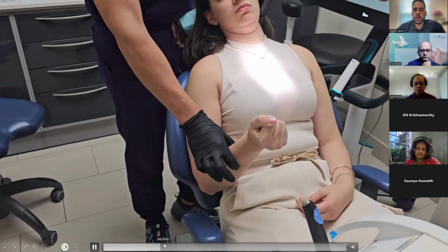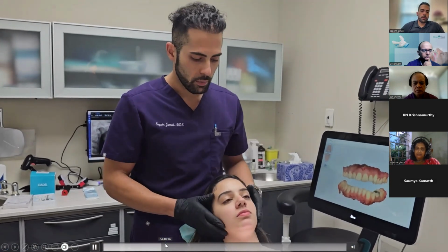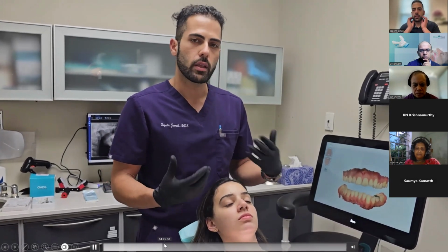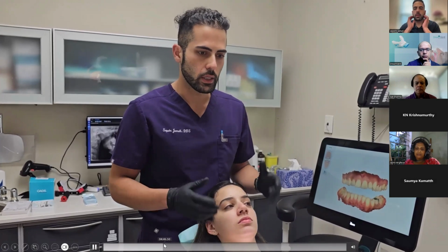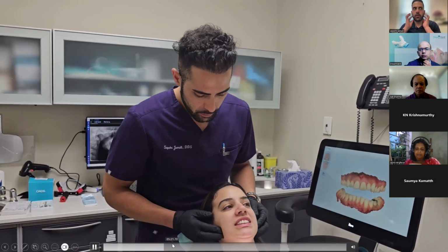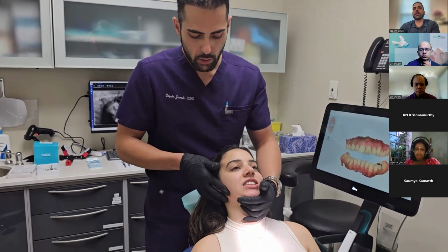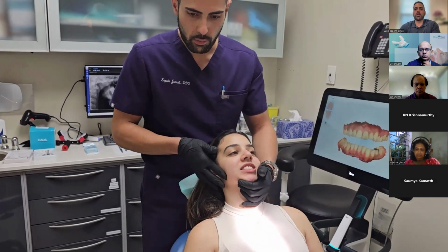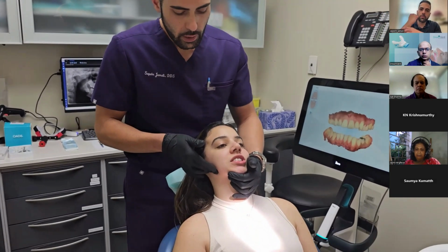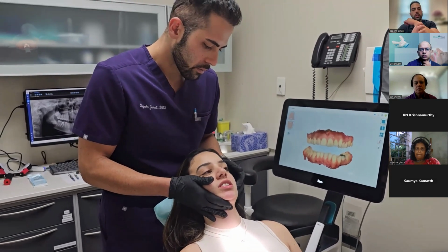This part is actually interesting. A lot of times patients don't know how to feel the tenderness because they never check the muscles of their face. So you start palpating their muscles and say, do you feel any tenderness? They say it feels a little bit tender because you're pressing on it. I say, okay, but does it feel tender like normal tender? And they don't know what tenderness in the muscle is. So I usually touch their hand and put the amount of pressure that I'm going to use for palpation of the muscles. And I ask them, is it painful? Like here, so no, they feel the pressure, but no tenderness.